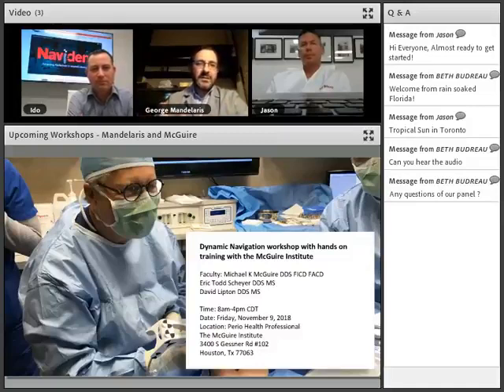The one thing about the jaw tracker, the MaxiRef, the head tracker, Jason, is that for those of us that tend to drape the patient from top to bottom, it does get in the way a little bit. So you feel like you're doing maybe not as sterile of a procedure. One of the other things that we need to also be mindful of, because there will be critics, is that when you use the implant as a drill tip and you're registering the implant, there is the question: is there a potential now to develop a retrograde peri-implantitis?